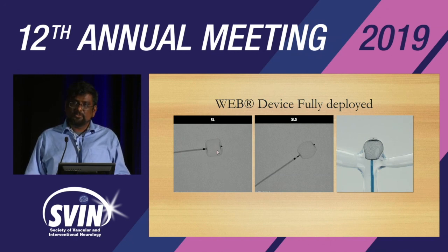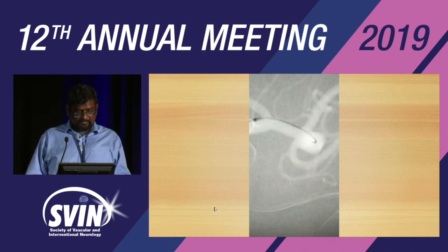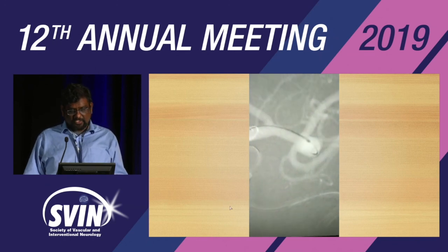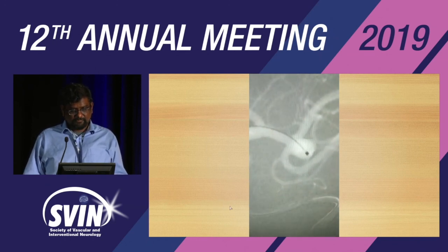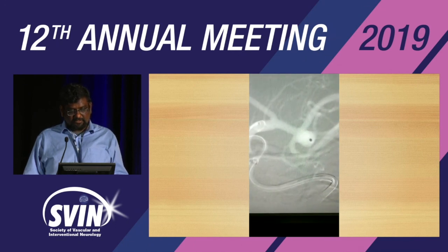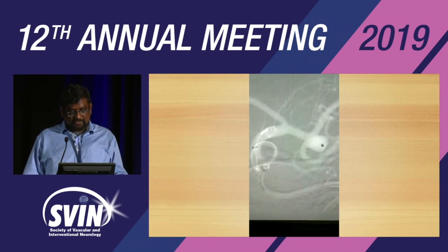Now, if it looks too good, like if it looks like the web you saw outside the patient, that means there's not good wall apposition. You should see some deforming because the wall is catching onto it. If it looks just like this, no good. So here's how it goes. This is a Synchro microwire via a 21 in this MCA bifurcation aneurysm. Next, we're advancing the WEB device. Some of these slides are from my friend, Dr. Delgado.